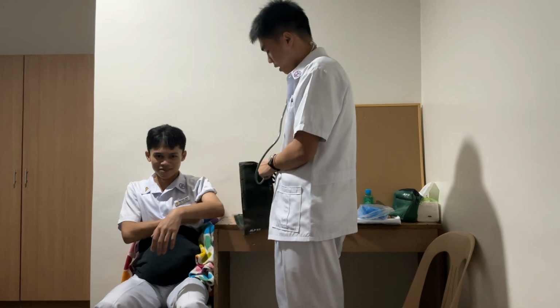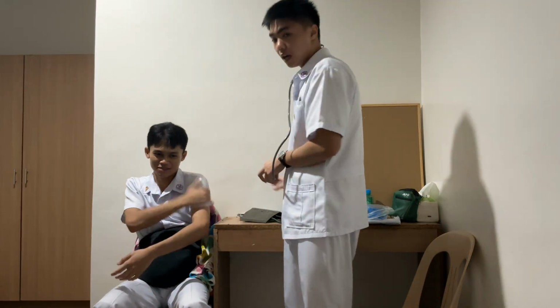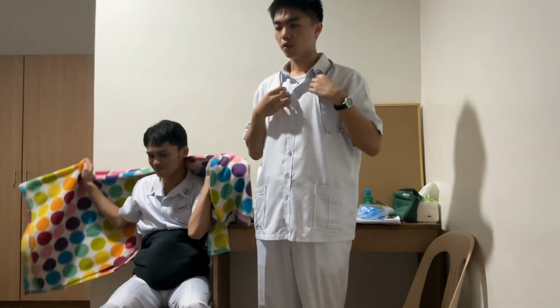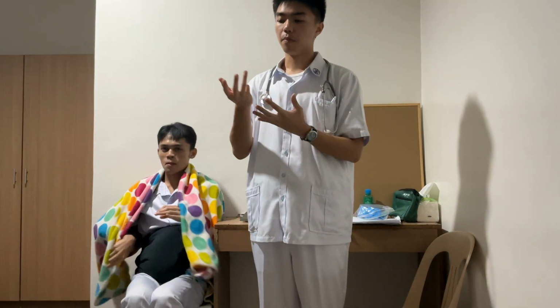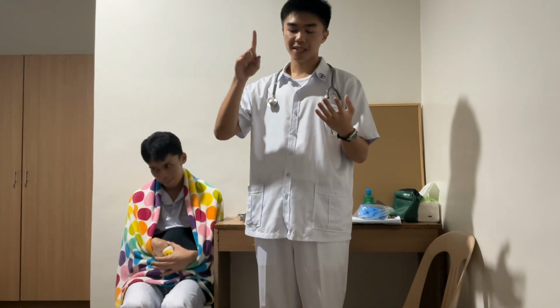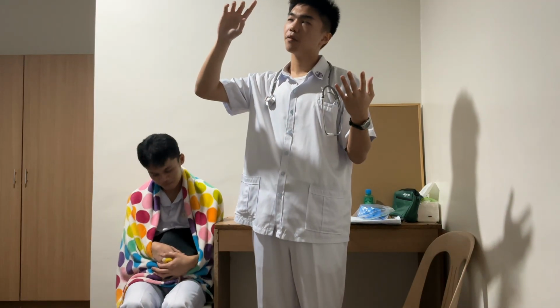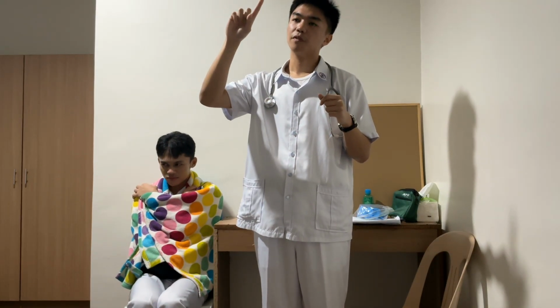So let me just explain what I was listening to. Basically, I pumped up the sphygmomanometer to about 30 millimeters of mercury up, and then released it slowly. So what was I hearing? Korotkoff sound 1 is the first tapping sound heard during deflation. So our systolic BP, we get to hear it first, the first click when deflating the cuff, 1 to 2 millimeters of mercury per second.